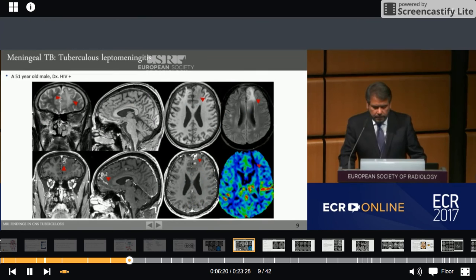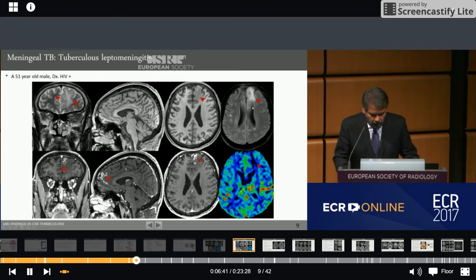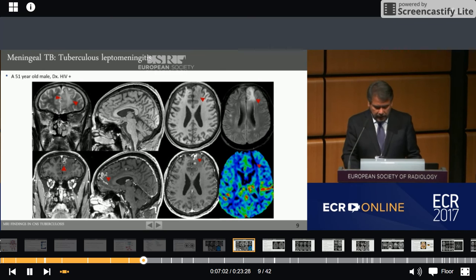This is a 51-year-old male with a positive HIV diagnosis. The T2, T1-weighted, and FLAIR images show an area of vasogenic edema in the left superior frontal gyrus. Post-contrast T1-weighted images show patchy gyral enhancement associated with meningeal enhancement. RCBV color map shows marked hypoperfusion with no evidence of high perfusion areas in the peripheral enhancing portions.